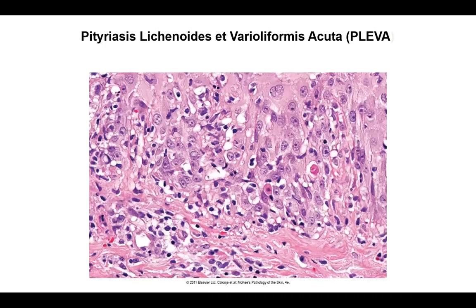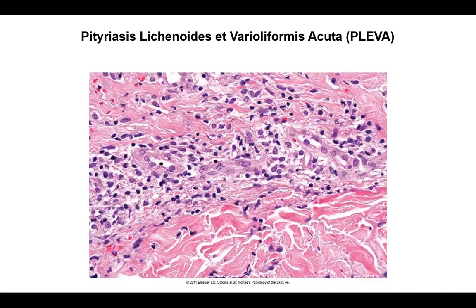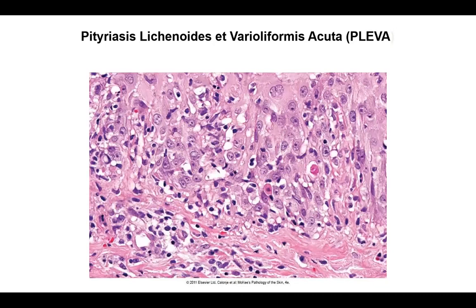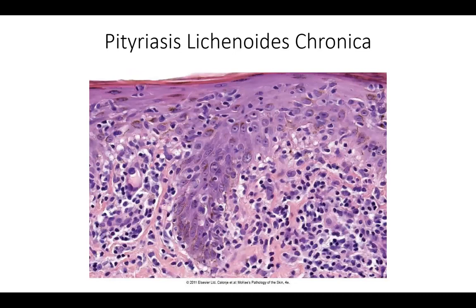PLEVA often shows perivascular lymphocytic inflammation and areas of extravasated red blood cells. As disease progresses from PLEVA to PLC, the inflammation diminishes. PLC still has key findings — parakeratosis, vacuolar or lichenoid interface change, dyskeratotic keratinocytes, and perivascular inflammation with extravasated red blood cells — but with less magnitude. Clinically, PLC lesions are not ulcerated, just scaly and flatter. On high power, PLC still shows a recognizable lymphocytic interface dermatitis.